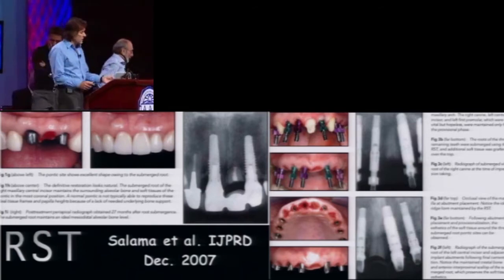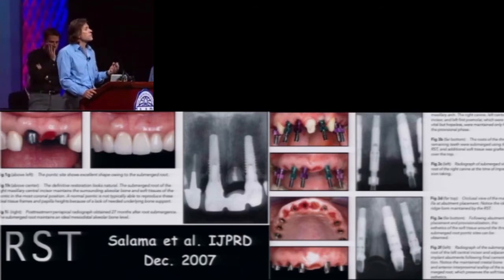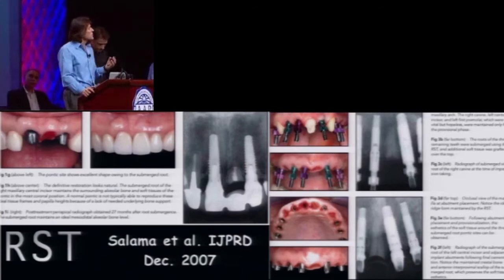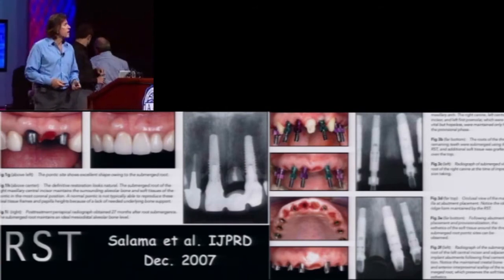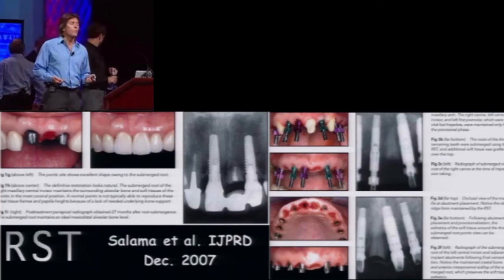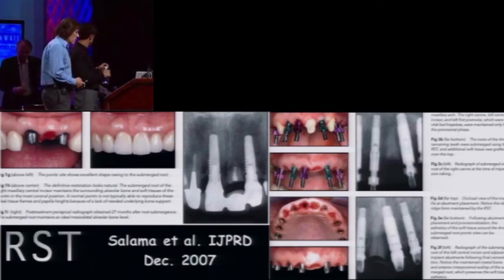So you can see the intention was for us to preserve the ridge by simply not extracting the root. And by doing this, we cut the root 1 millimeter above the bone, maintaining the horizontal insertion fibers of the connective tissue, which supports that interdental height and is maximum preservation of the tissue.